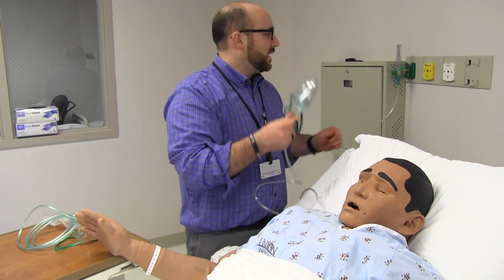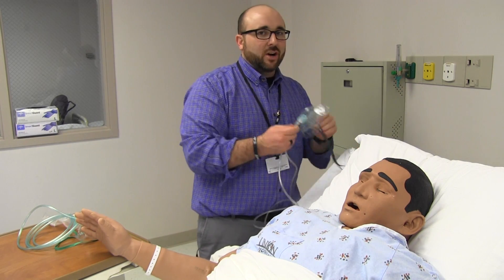So that's the simple mask. You won't see a lot of those around, but just in case you do — it's kind of a generic oxygen device.